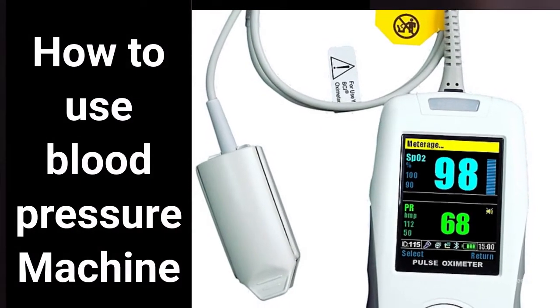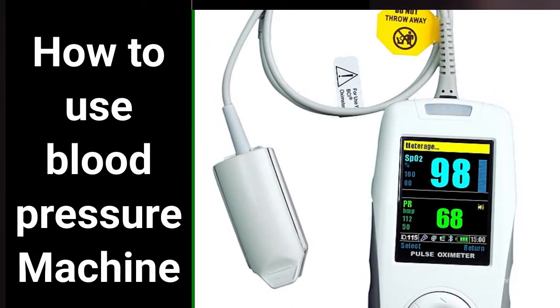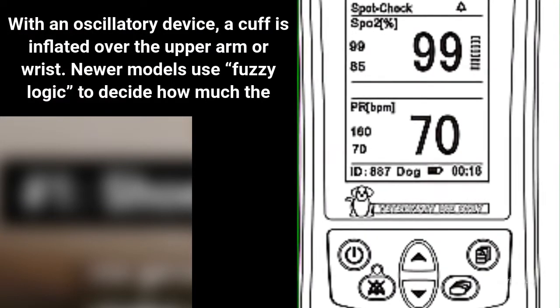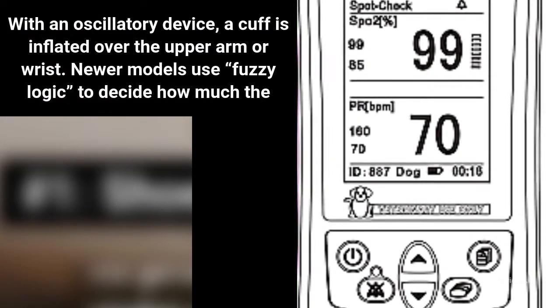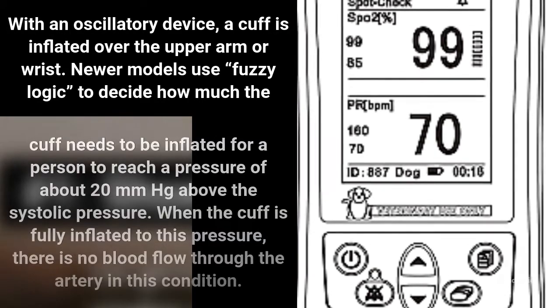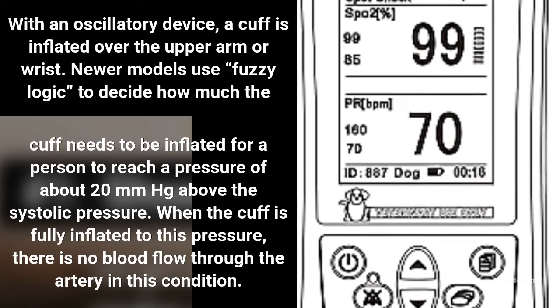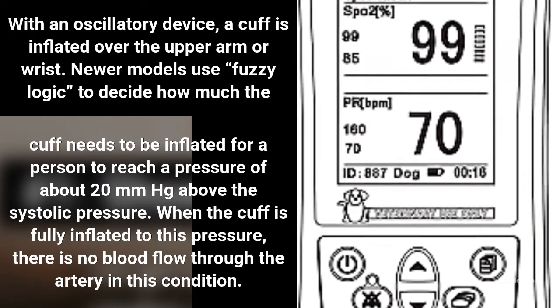How to use a blood pressure machine. With an oscillatory device, a cuff is inflated over the upper arm or wrist. Newer models use fuzzy logic to decide how much the cuff needs to be inflated for a person to reach a pressure of about 20 mmHg above the systolic pressure.